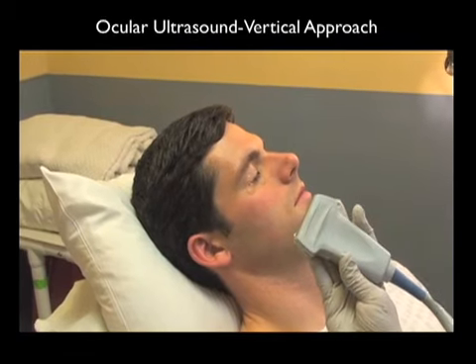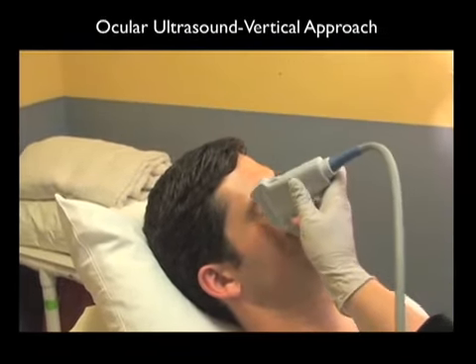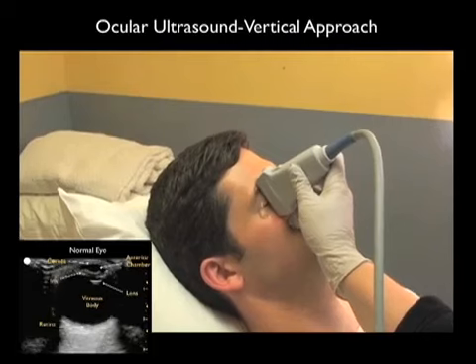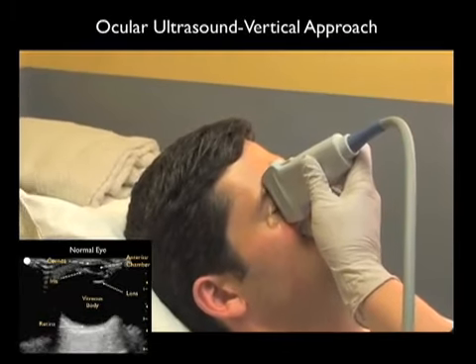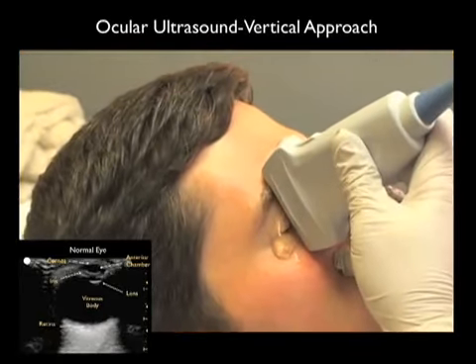To complete our examination of the eye, we should also perform ocular ultrasound from the vertical approach, having the probe in an up and down configuration. Note here, we're again scanning through the closed eyelid. Now we have the probe marker up towards the patient's head. We want to scan from side to side to fully investigate the eye in a second plane for any signs of pathology.